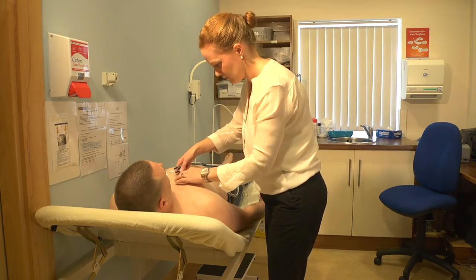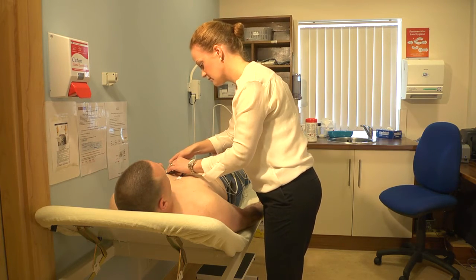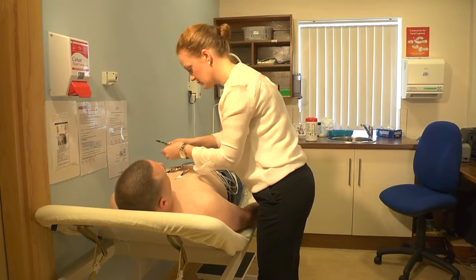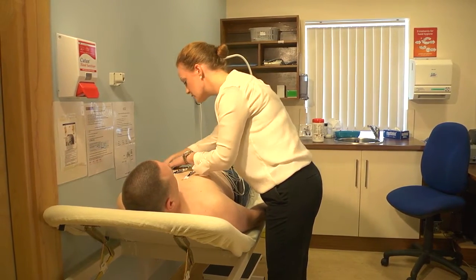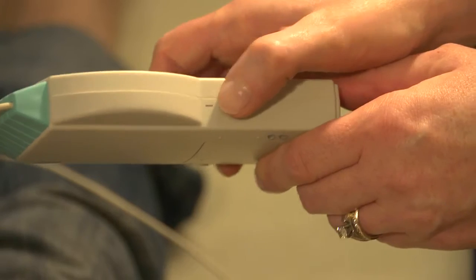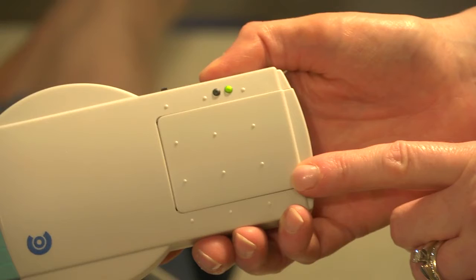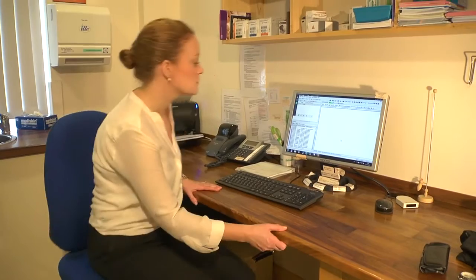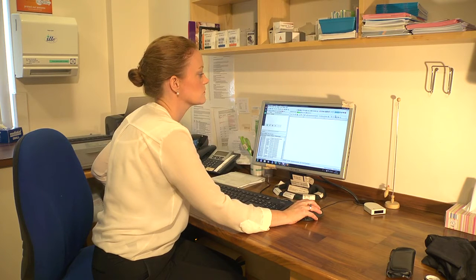The chest leads are attached the same as any ECG device. Now the nurse has to turn the ECG machine on by pressing the button, and you can see the green light comes on when the ECG is on. That's the complete setup. The nurse now goes back to the computer and clicks on the ECG ProMed custom icon.